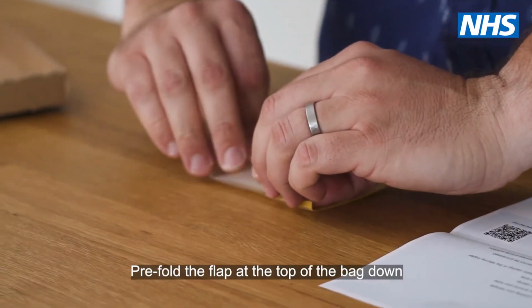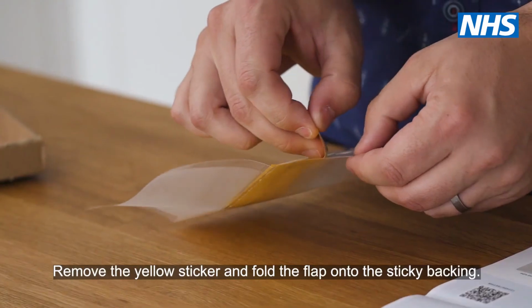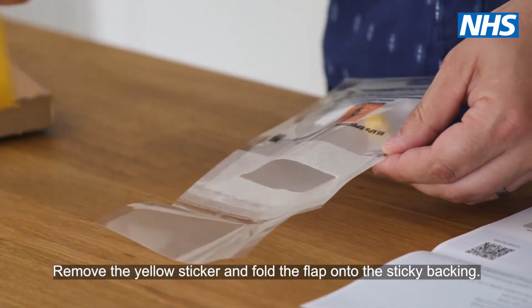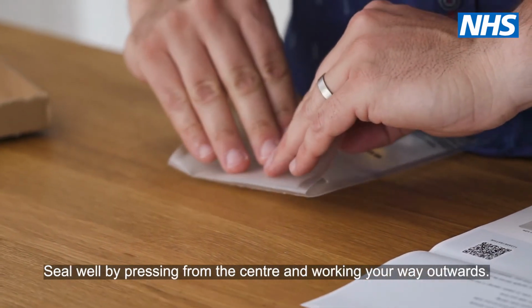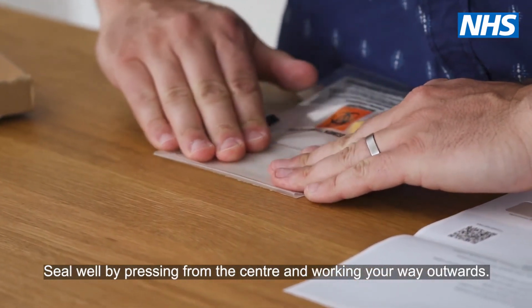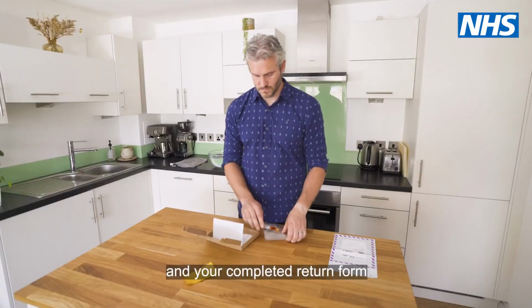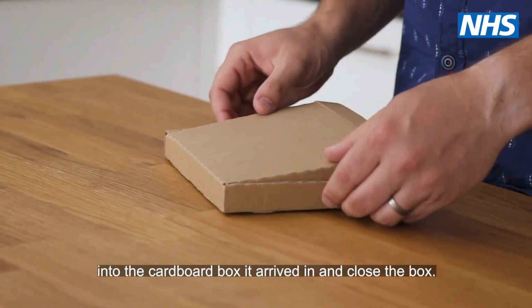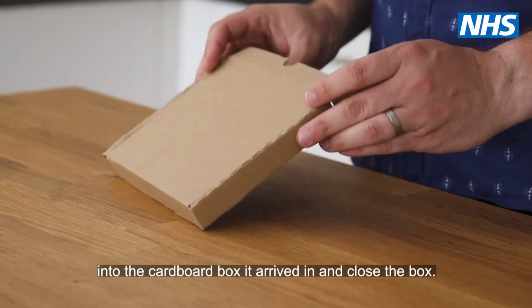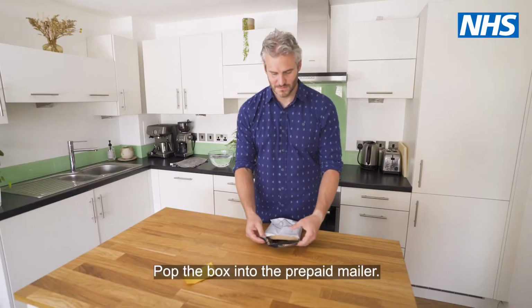Pre-fold the flap at the top of the bag down. There is a natural fold line. Remove the yellow sticker and fold the flap onto the sticky backing. Seal well, pressing from the centre and working your way outwards. Put the sealed plastic bag and your completed return form into the cardboard box it arrived in and close the box. Pop the box into the prepaid mailer.